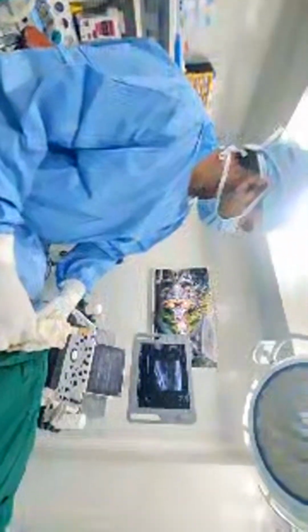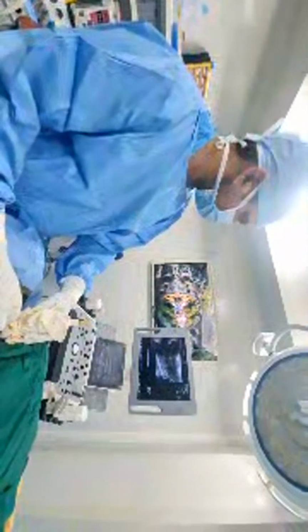So left lobe of thyroid nodule. Patient able to swallow, but it moves with the swallowing. This is the thyroid swelling, which is approximately around 60 cc. This is the longitudinal section.